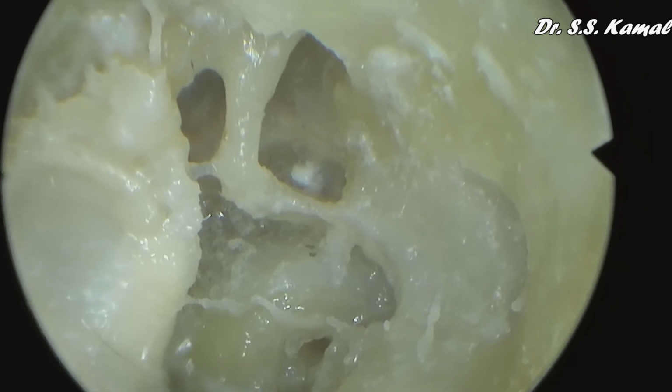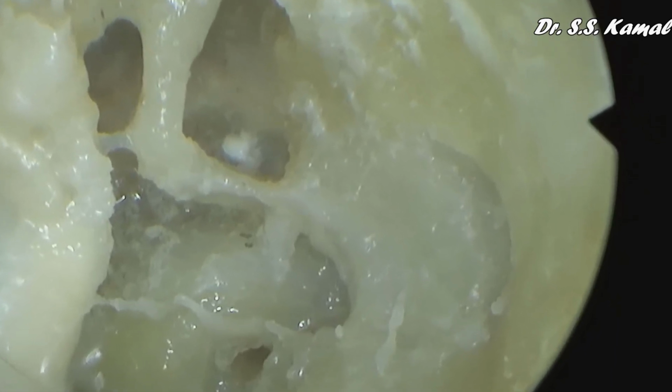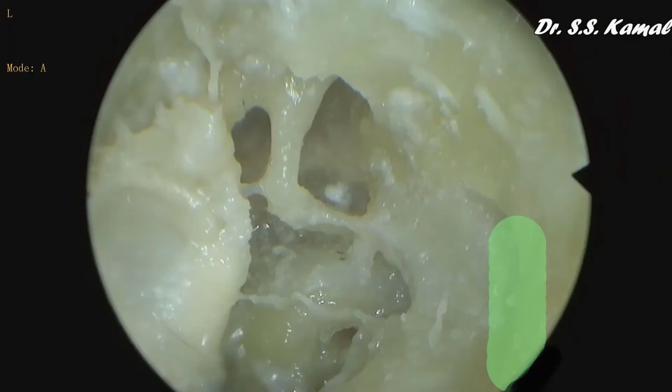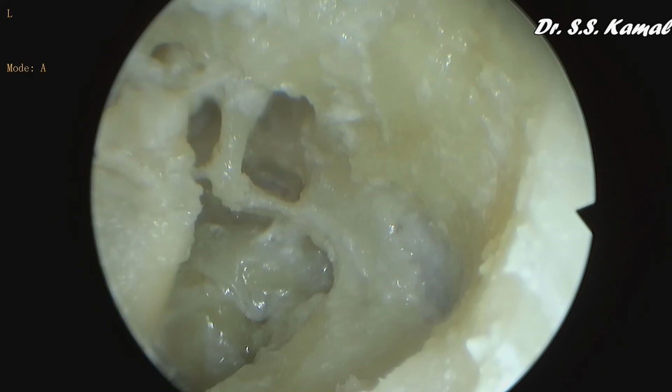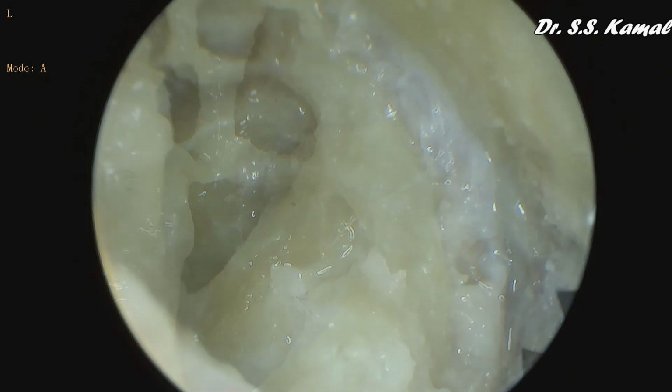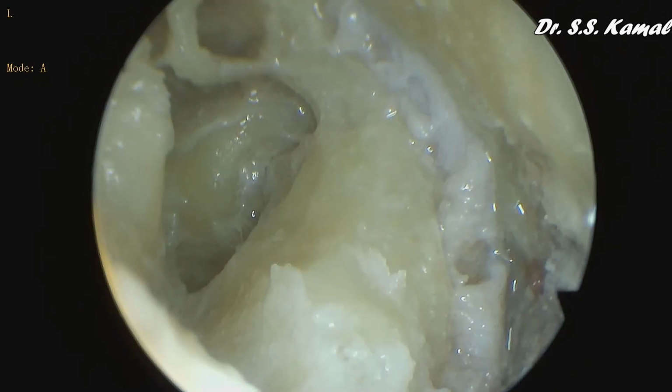After removal of the bone lateral to the facial recess, by this initial dissection, the pyramidal eminence is now clearly visible. The green area on the posterior canal wall, vertically running from the base of the pyramidal eminence towards the floor of the external auditory canal, is indicating the presumed area of mastoid segment of facial nerve. A progressive dissection along this vertical plane from medial to lateral direction ultimately exposes the mastoid segment of facial nerve.